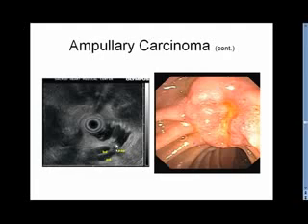Here you can see that a little bit in a different aspect. This is the endoscopic appearance of this papilla, which looks quite abnormal. Biopsies came back as showing adenocarcinoma.